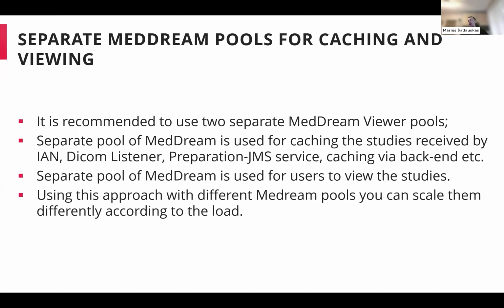So let's say you configure your temp cleaner to remove the cache older than 1 week, 2 weeks, 1 month, and so on. For this you could also use the caching MedDream pool, and the other pool for the users would remain without any additional workload, only the workload from the users who open and view the studies.